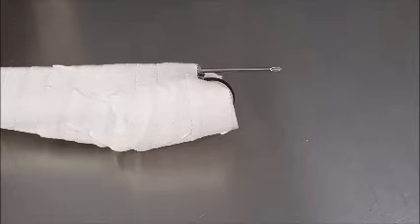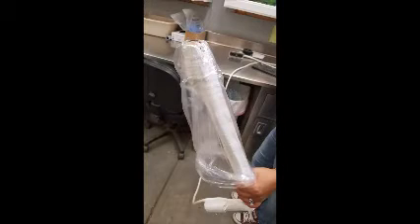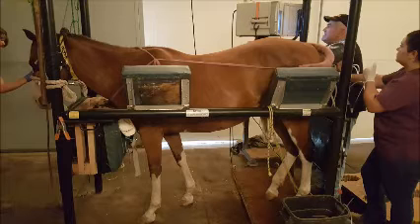This allows us to have the needle protrude above the ultrasound where we actually place the follicle for penetration and aspiration. Once the probe is assembled, it is coated with sterile lube and then covered with a sterile sheath so no infection is introduced into the mare. The mare is placed in the chute, tail wrapped, washed, and then the probe is inserted in the mare's vagina.